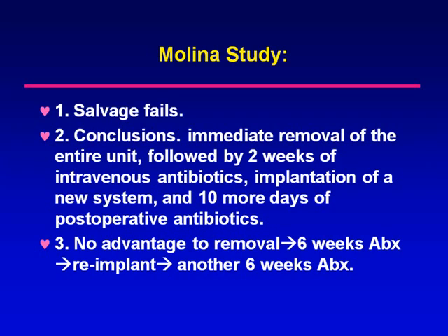So there is no advantage to removing the entire system, waiting for 6 weeks of antibiotics, which was part of the study, then re-implanting, and then going on for another 6 weeks of intravenous antibiotics. There was an era that I can remember when our IV people did want us to give people 6 weeks of antibiotics after the removal of the system, and didn't like us to put in a new one until, if not 6 weeks, at least many weeks of antibiotics beforehand. So things had come down, and the new study from about a decade ago was the first to show that you do need to take everything out, but maybe you don't need to spend weeks and weeks before moving into the next step.